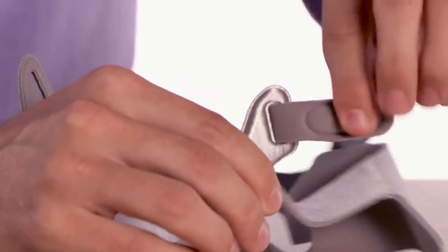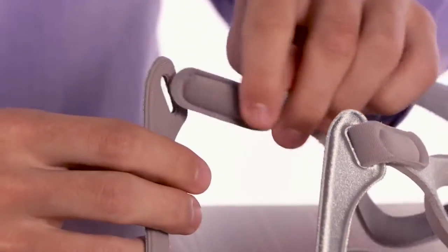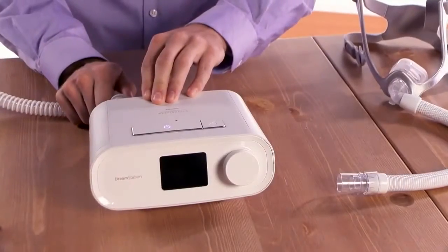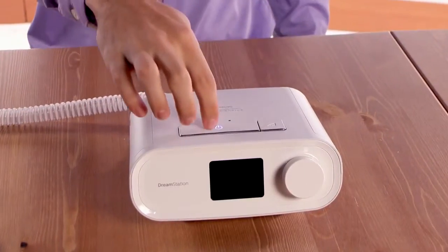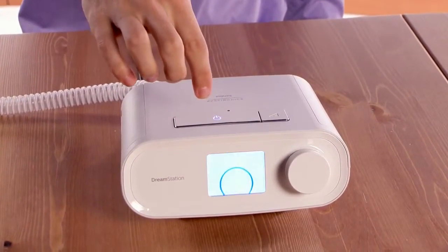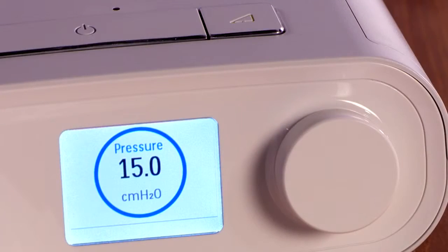Put on your mask and headgear. If you have questions about your mask, please refer to the mask instructions. Connect the tube to the device and mask. Press the therapy button on top of the device to turn on the airflow and begin therapy. The current delivered pressure will display on the screen.